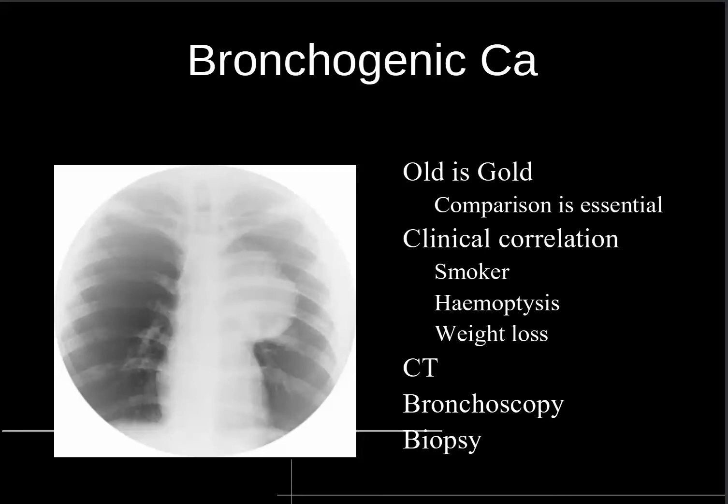The best way to help diagnose is to look at old X-rays, if the patient has old X-rays, and see how quickly this has developed. I mean, lung cancers do not grow as quick as infection. So if it wasn't there in the week before and now you've got this mass, it's not going to be a cancer. It must be something else.